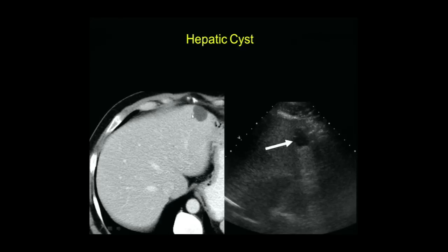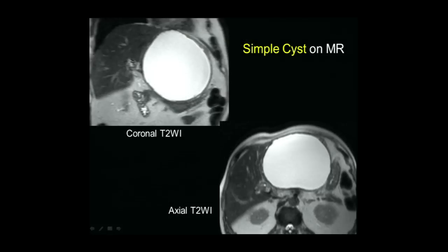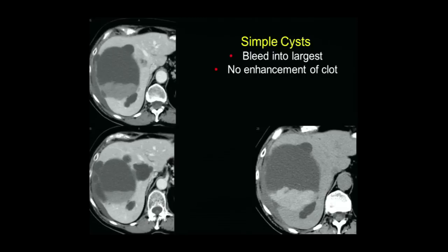Here's a hepatic cyst on CT and ultrasound — there's a little septum, which is okay. Note through transmission, lack of internal echoes. Here's a simple cyst on coronal and axial MR: very bright uniformly on T2-weighted images, very dark on T1. Then we have a lesion that on the contrast-enhanced scan might appear to have mural nodularity suggesting a cystic neoplasm. The non-enhanced scan clearly shows this is clotted blood, measuring about 65 Hounsfield units. ROI before and after contrast shows no enhancement whatsoever — this is spontaneous bleeding into a large cyst.